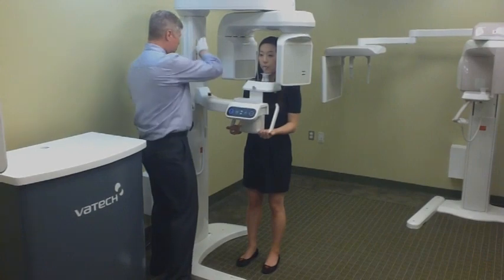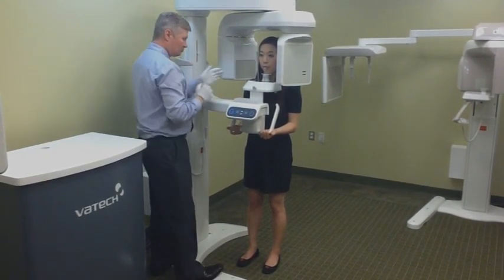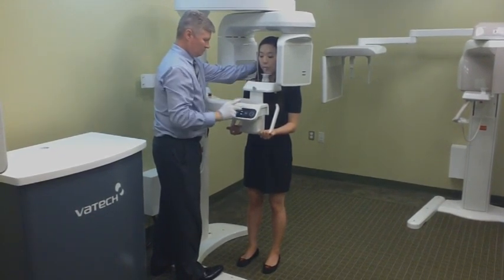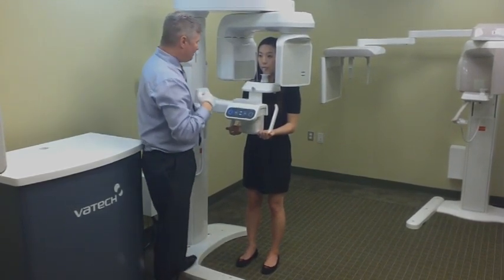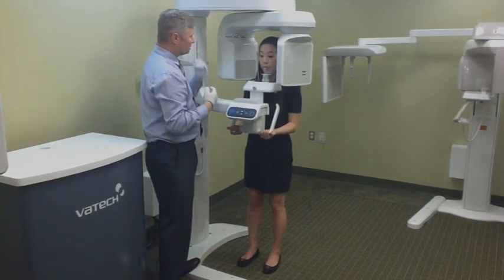Once I've made my adjustment, I'm going to come back over here again, move back up to the top of my tragus, maybe just one more final adjustment here, just like that, okay. And then just one more time here to the top of the tragus. And now it's about maybe half an inch or so down below your eyelid. Perfect, okay. Last thing I'm going to do now is adjust my canine light.